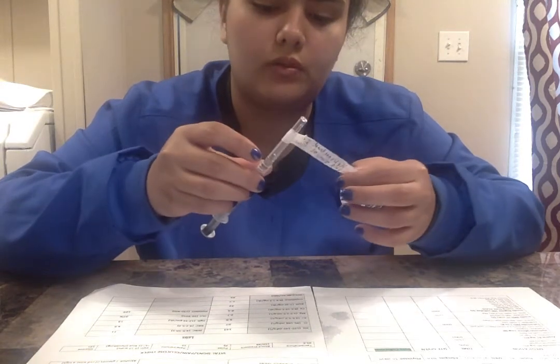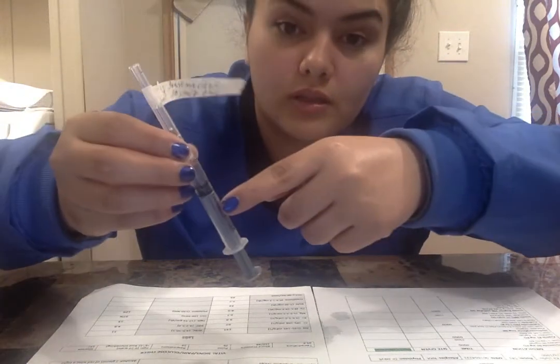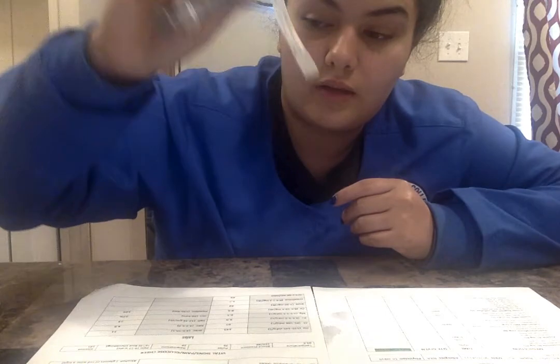because we do not want to put it over the numbers, because then we don't know how much medication that we drew up. And this is going into the med cart for safe transport, and so is the vial, so that I can do my third med check whenever I get into the room.